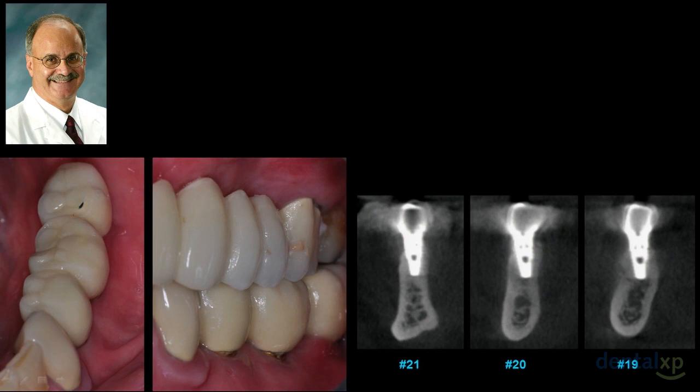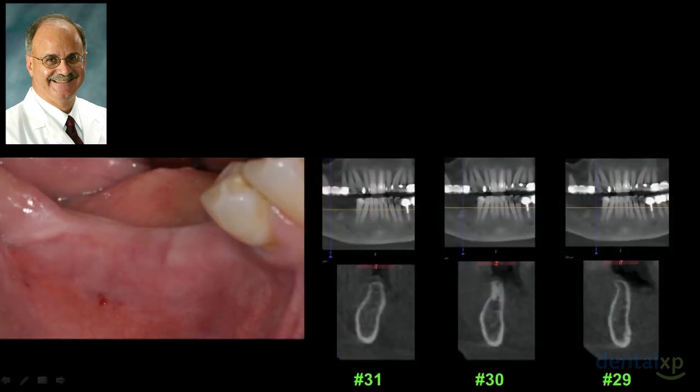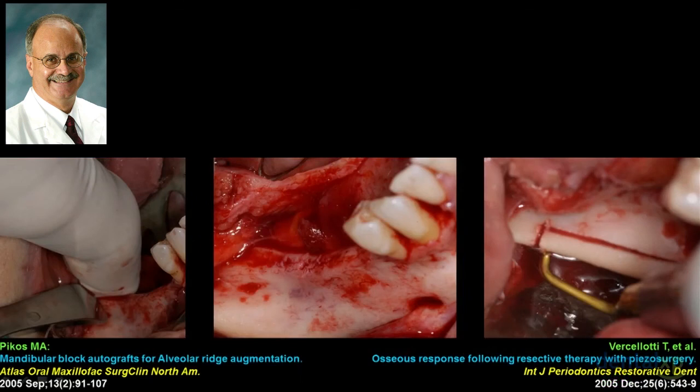We've grown bone predictably. And in this last case, just to compare and contrast with the other two, here we have a young lady in her mid-70s, fairly healthy. As we assess these cases, for me in particular, I'm going to give patients options all the time, as we should all certainly do, in terms of an autogenous harvest. In other words, can we take bone from her ramus buccal shelf? We're going to assess this because some patients don't have even adequate bone to do that. And she and I together agreed that this would not be such a bad approach for her.